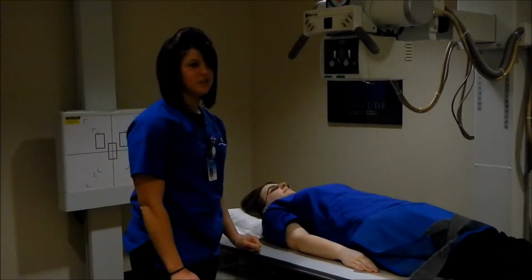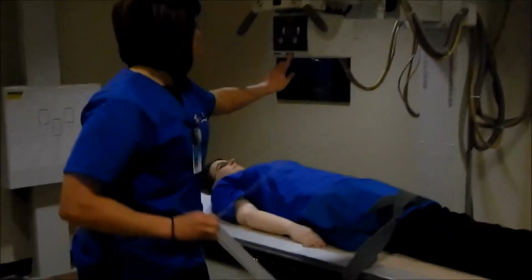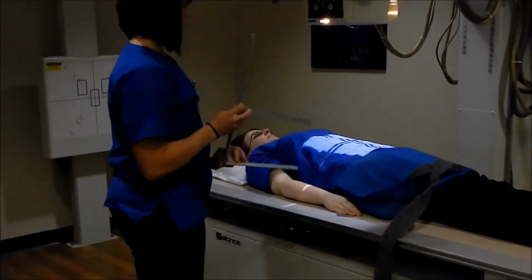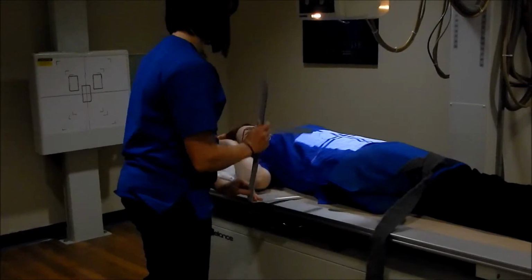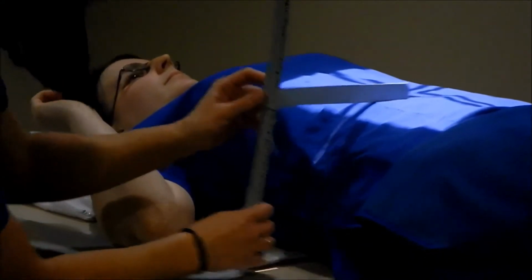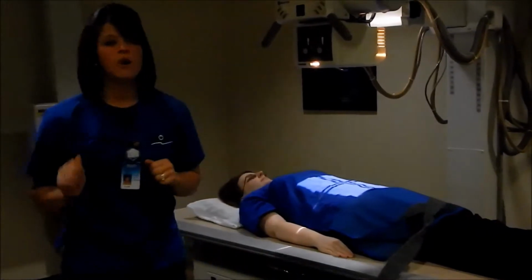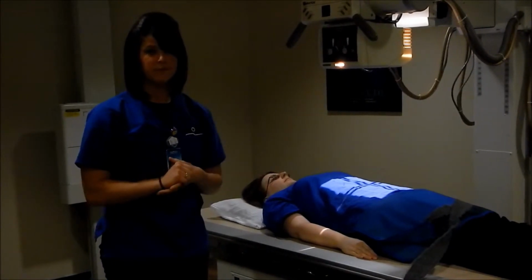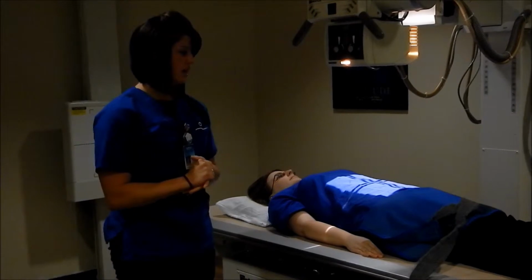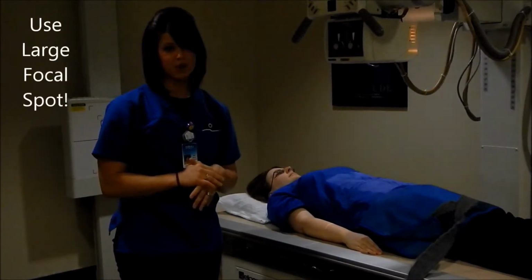The next thing we're going to want to do is measure the part, so I'm going to grab the calipers. We want to measure the path that the central ray takes in and out of her body. So if you could raise your hand up for me. Slide that under. And she measures 21 centimeters. The next thing you're going to do is go out and set your exposure factors. You're going to want to use all 3 chambers for the AEC. This exposure is taken on suspended expiration.